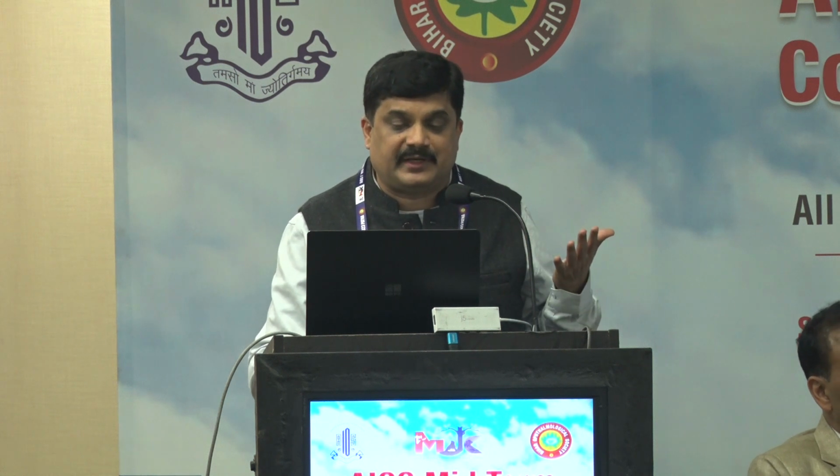Just for the introduction, biometry is measuring various dimensions of the eye, its components and their interrelationships, and using this data to determine the ideal intraocular lens power. Basically, biometry consists of keratometry reading and the axial length of the eye. If you go to any of the literature, claims relating to biometric error or wrong IOL power were almost the second most frequent cause of claims and resulted in payment damage of almost 62% of the closed cases.